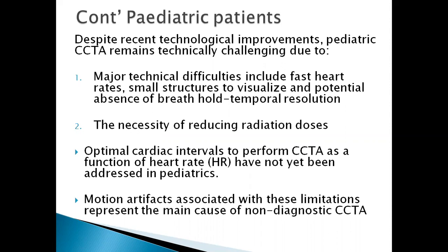However, certain studies have said that maybe there's room to study this. So if, for example, some optimal cardiac intervals are developed, if you can still get that high heart rate and then optimize it to cardiac intervals, maybe something can be worked out.